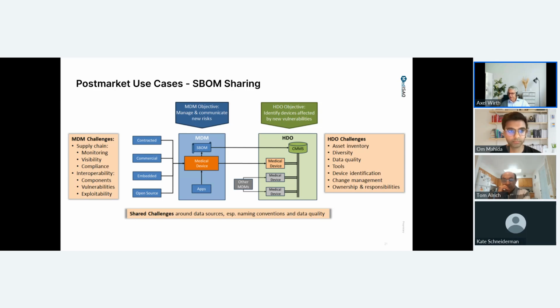There are many other industries that share some of healthcare's problems. For example, if you look at the energy sector, they have as many legacy devices with outdated operating systems as we have. They have the same maintenance cycle challenges we have in the healthcare industry, that they may only be able to apply patches, for example, on an annual basis rather than immediately. But the diversity of equipment from many different manufacturers and devices of many different security maturities, I think, is unique to the healthcare industry, and that is a unique challenge we face.